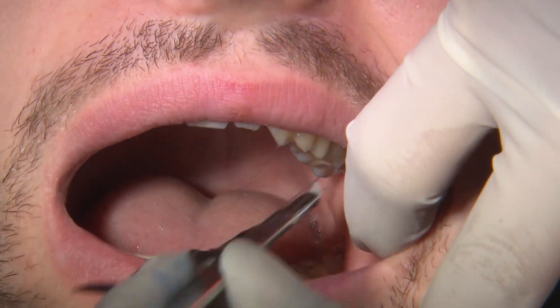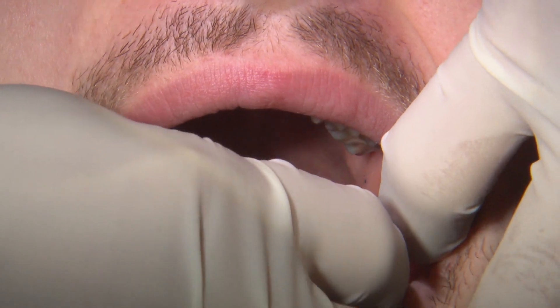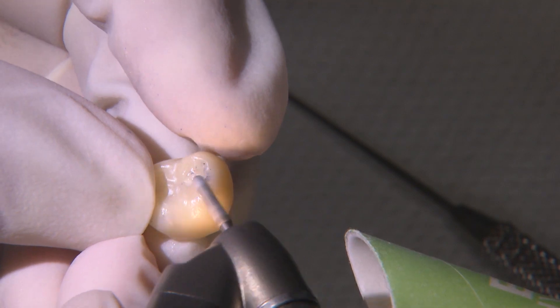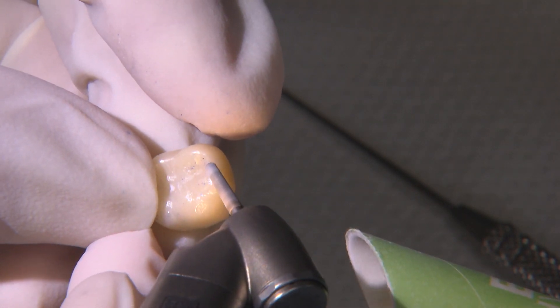Next, I check the occlusal contacts, again with troll foil articulating paper. By dialing in my preferred contact settings in the design software, there's typically very little to no adjustments needed.